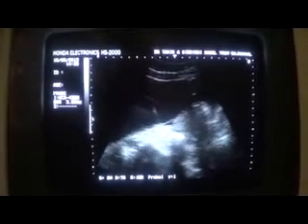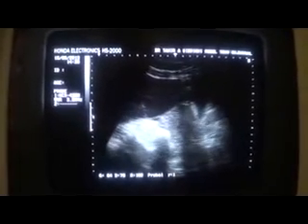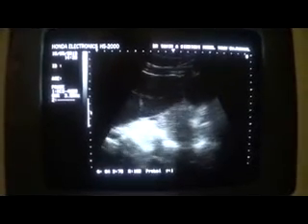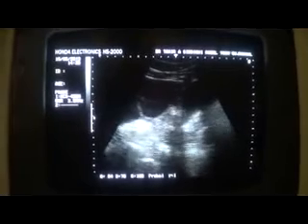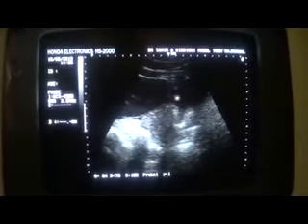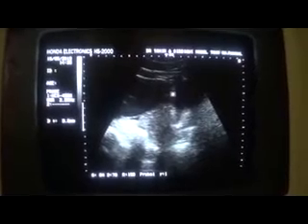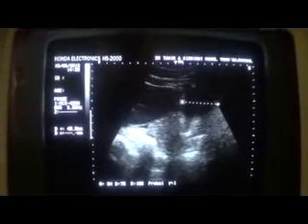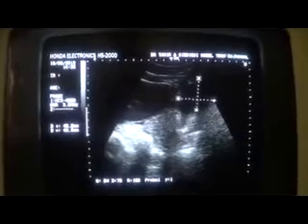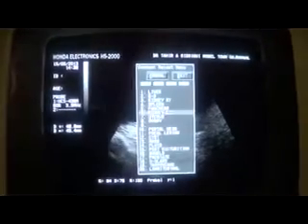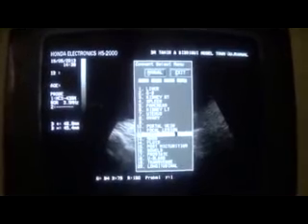This is a pelvic ultrasound of a 40-year-old female. This is the longitudinal section. There is no history of operation or surgical intervention in the past. This is the urinary bladder — it is an underfilled urinary bladder. I am performing this ultrasound with an underfilled urinary bladder rather than an adequately filled urinary bladder.